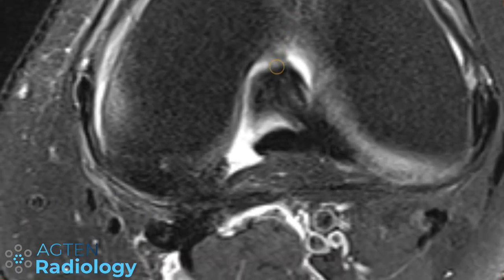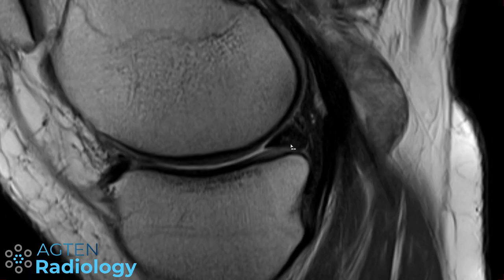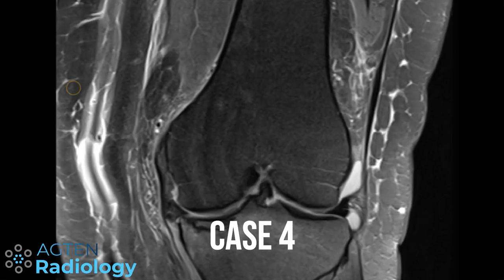Let me make this a little bit bigger. So this is the PCL, and we know that the posterior root of the medial meniscus should insert in this region, and you can nicely see the gap here, and this is the posterior horn of the meniscus. The root is torn here like this and slightly retracted because we have an extrusion. Once the tear goes through here, the meniscus is not stable anymore and therefore can extrude to the medial side. So if you will, with the ossicle and tear, you might call this a ghost meniscus, but I don't really would use this term here because it's a root avulsion and not the classical radial tear of the posterior horn. And that brings us to the next patient.